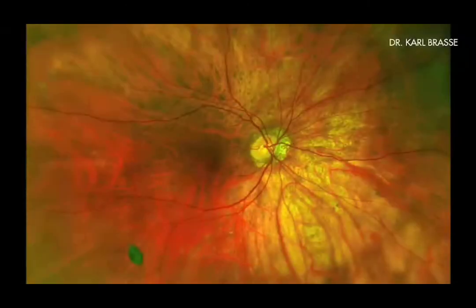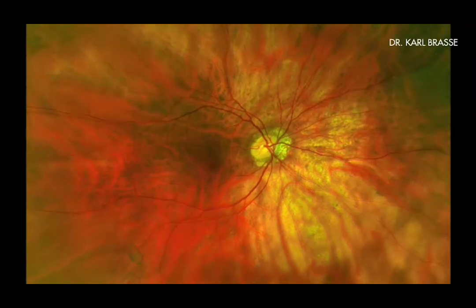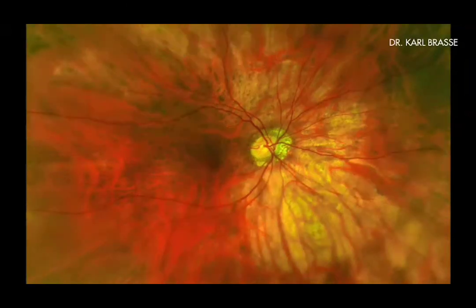All floaters which originate histoanatomically from the retina belong to group 1. A classic example is an operculum from a round retinal hole. Patients are not often bothered by it. In case they are, treatment is possible. But as the operculum usually is far off the optical axis, access for the laser beam is technically difficult and might require contact lenses with prisms.